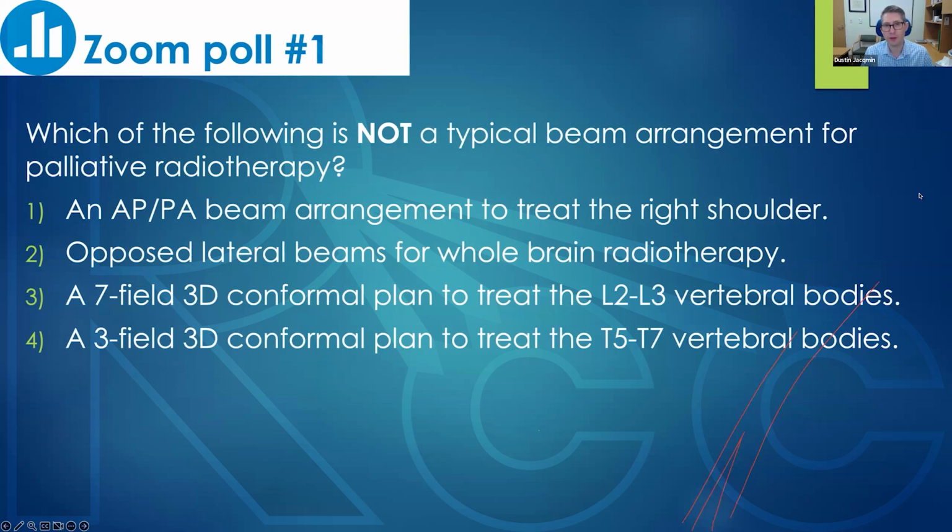We did commission this technique specifically. So we created a bunch of plans with this dose rate modulation, and we measured them and more or less determined that our treatment planning system was able to create these plans safely. And that was sort of where we landed on that.